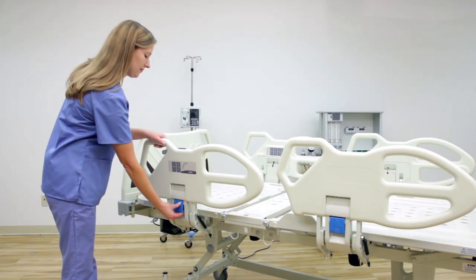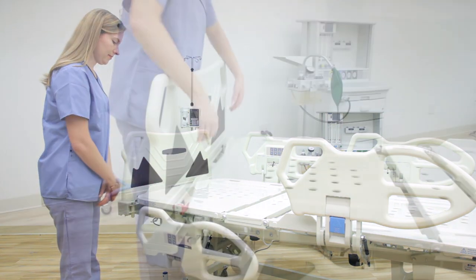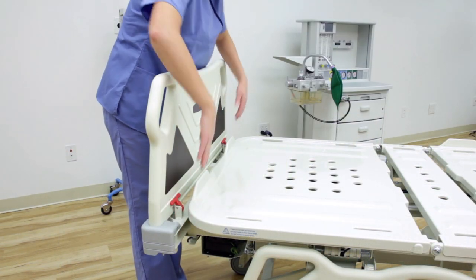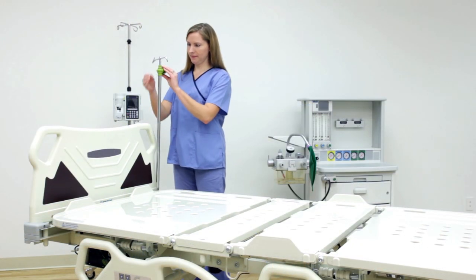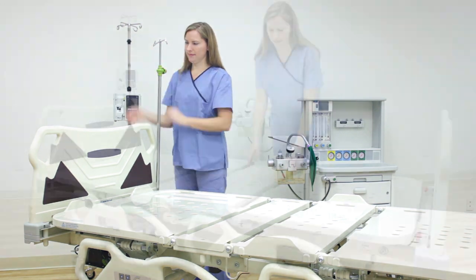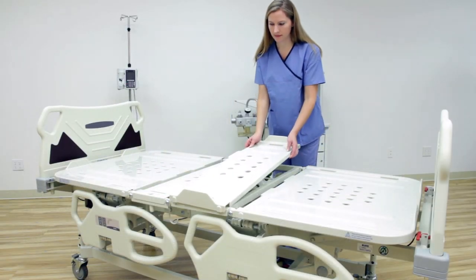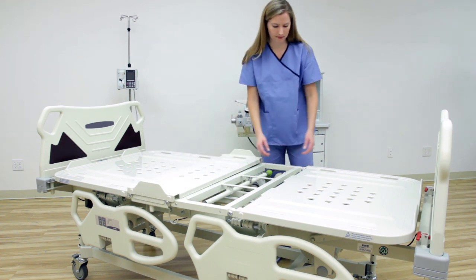The Premio has four independently moving side rails that are easily folded away. Both the headboard and the footboard can be removed. Six IV pole holders line the side of the Premio. Remove the segmented mattress base to properly sanitize and disinfect all of the surfaces on the Premio E250.